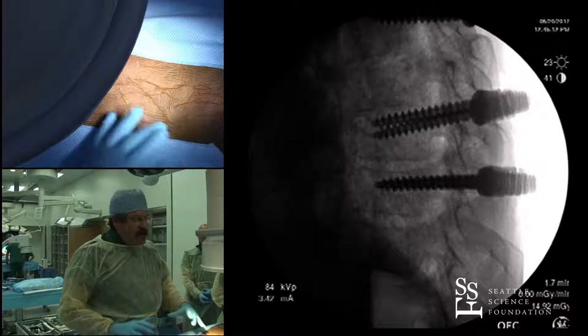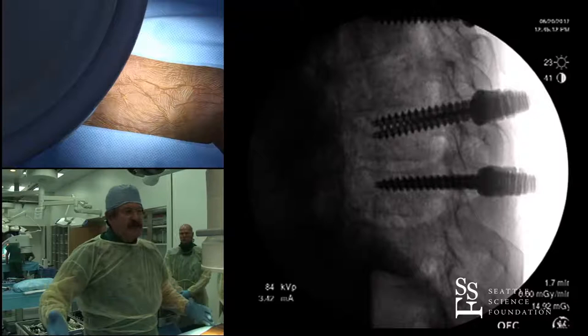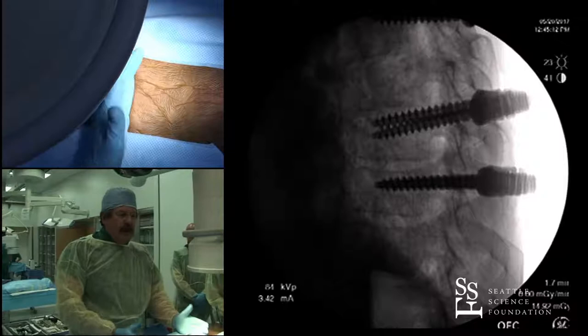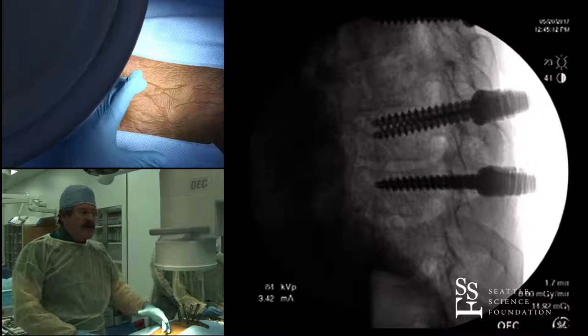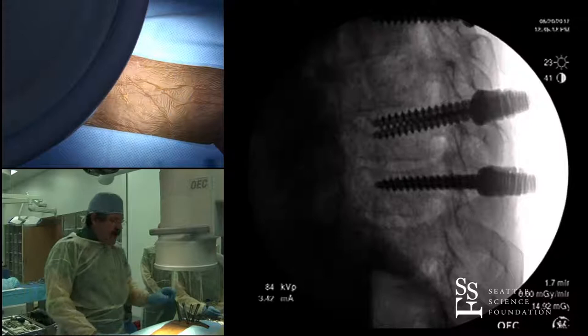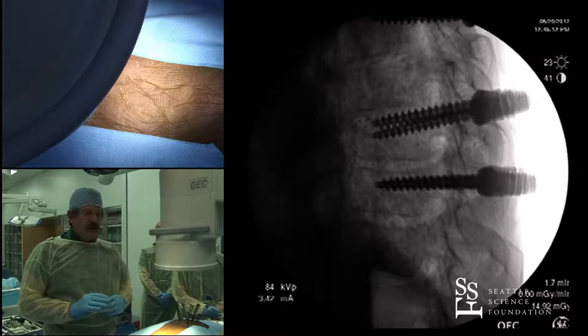At least four screws above and four below, and I don't need to put them right next to the fracture — I can spread them out. With ankylosing spondylitis, we can spread them out as much as we want, using six screws above and six below. I'll put a set of screws right next to the fracture, then skip a level or two and put another set. I want long lever arms — just like an external fixator, which becomes stronger with screws near and far from the fracture.